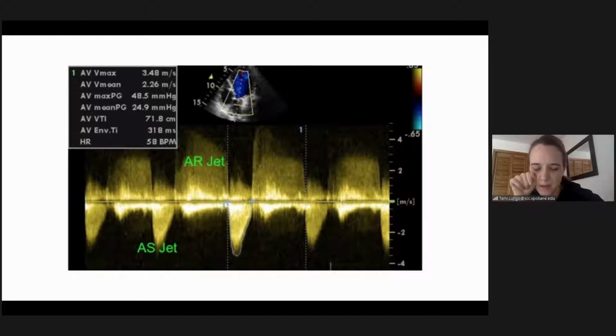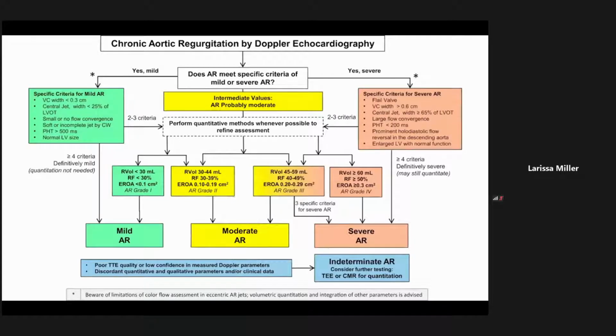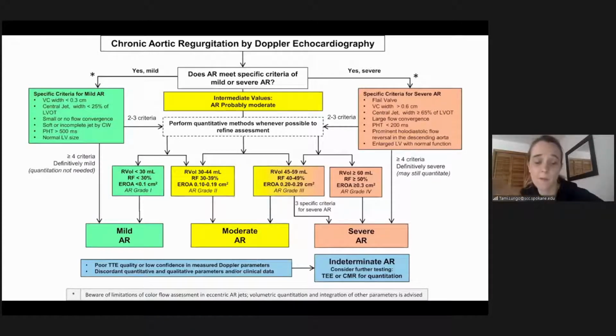But this is kind of splitting hairs on this one, because they probably did incorporate everything, but it could be a little bit overgained. It's hard to tell on a still picture. But according to the other ones, they don't look nearly as much. This is basically kind of a crazy slide. I'm just showing that it doesn't have the moderate.